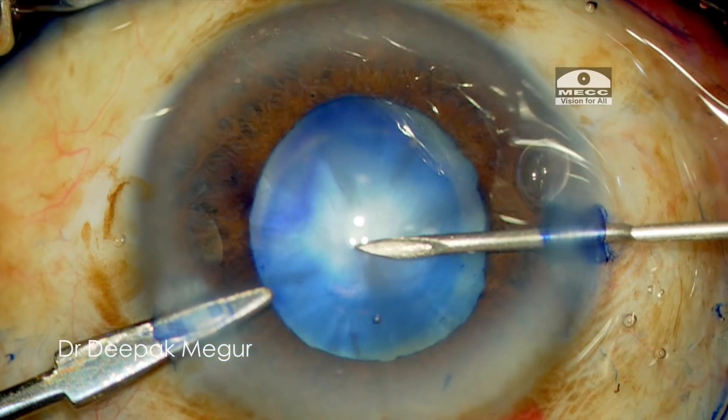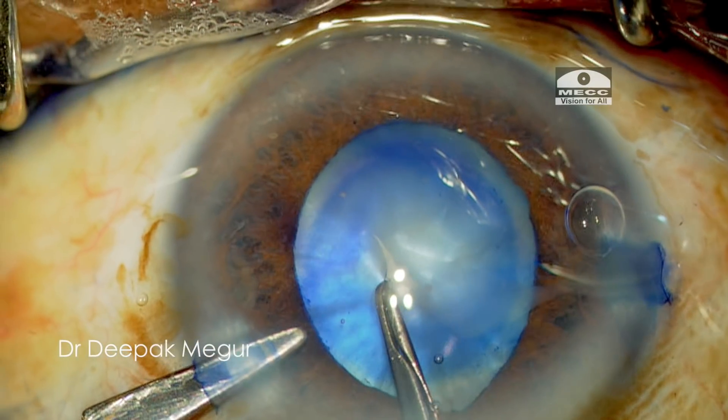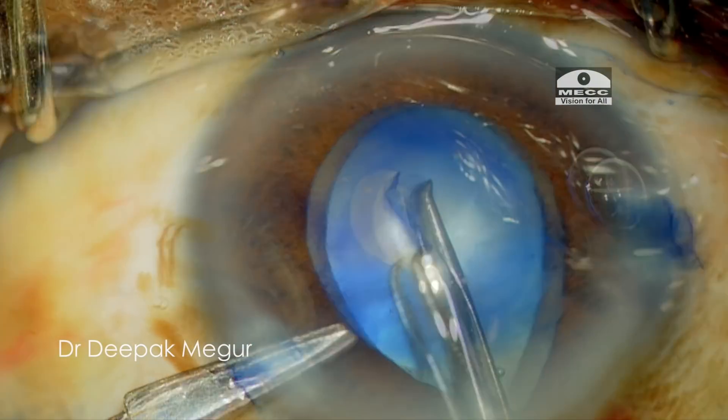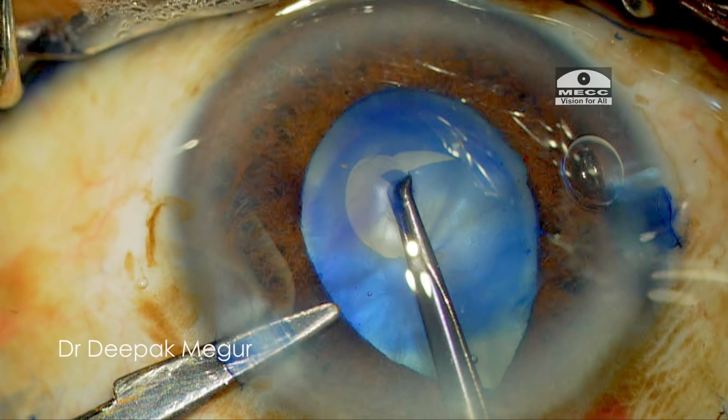I'm aware that I'm dealing with a swollen cataract, and as soon as I puncture the capsule I go back to my forceps to perform the initial small capsulorhexis. As soon as I'm trying to perform it, I can see that the rhexis is hinting at running away because of the raised intralenticular pressure.